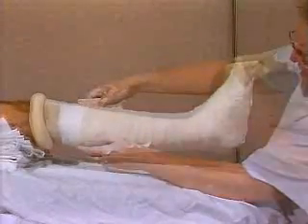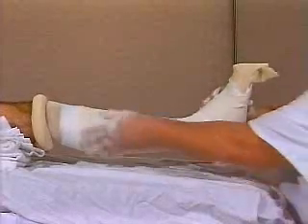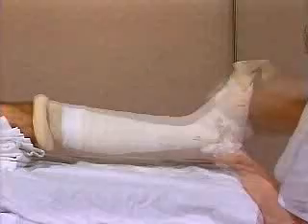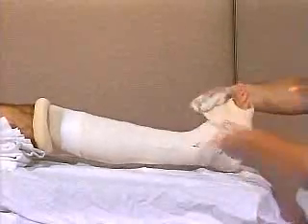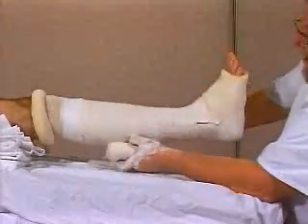Apply a second layer identical to the first. Smooth the layers and fold down the padding at the toes. Work a third layer from proximal to distal.